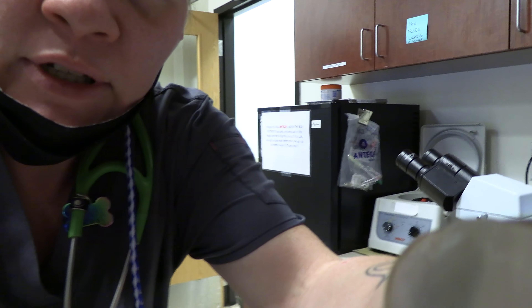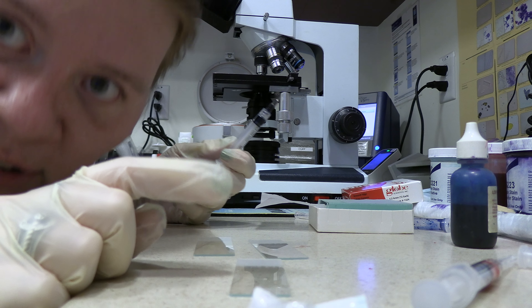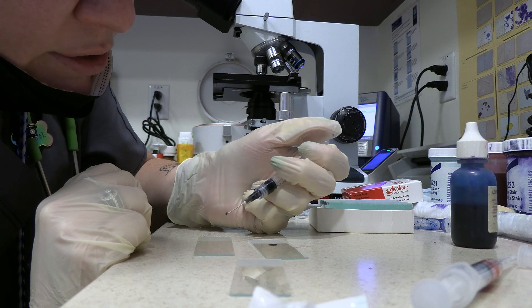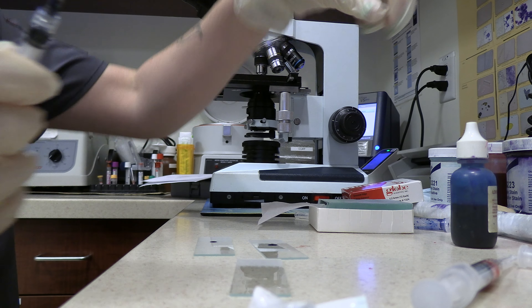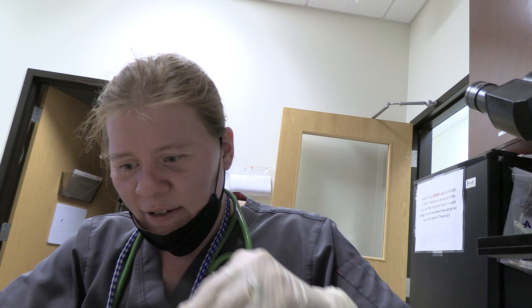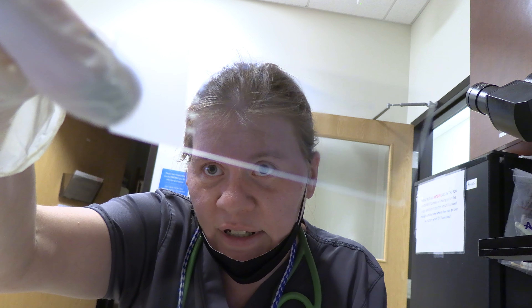I'm going to put the camera down here so we can see the blood smear being made. You just want a little drop so you can get a nice feathered edge. And we'll do our smooth smear line — it may look a bit harder, but it's not.